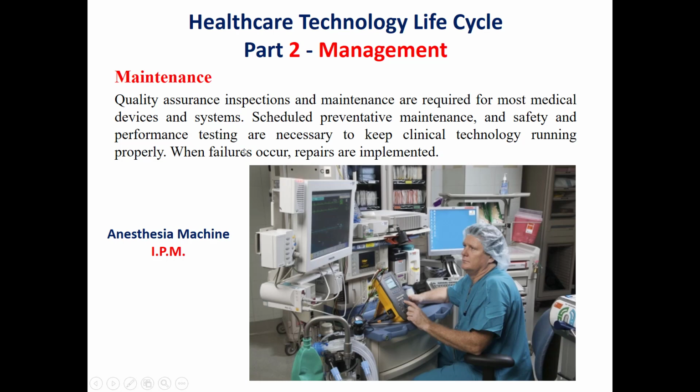In case failures occur, repairs are implemented. Also, retraining of staff if the failure is a result of user error. So maintenance is a very essential part. It's important to mention we have different types of maintenance.